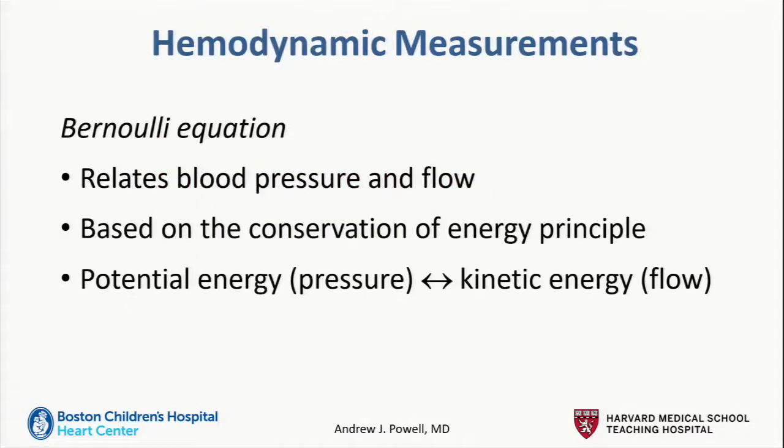So hemodynamic measurements, we're going to begin with the Bernoulli equation. And what this equation really does is it relates blood pressure and flow. And it's based on the conservation of energy principle. And really what we're doing is we're going back and forth between potential energy in the form of pressure to kinetic energy and flow. And we're saying, yes, you might go from one form of energy to the other and back again, but all that energy needs to be preserved.